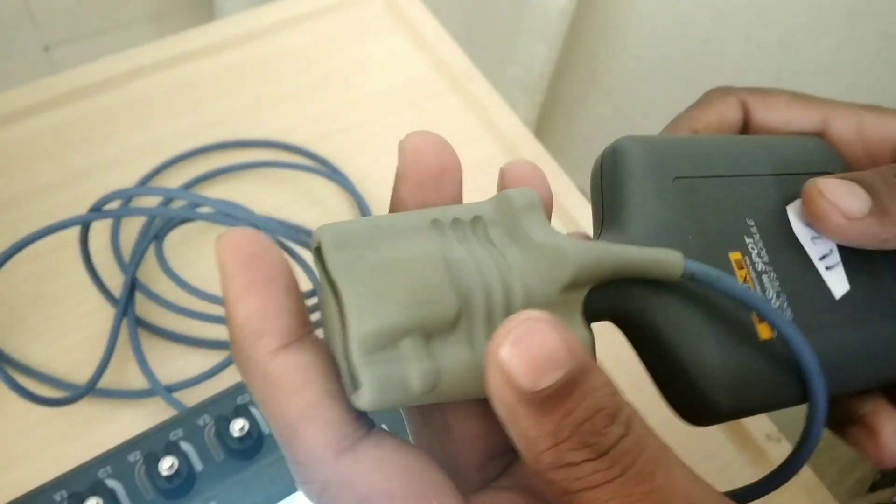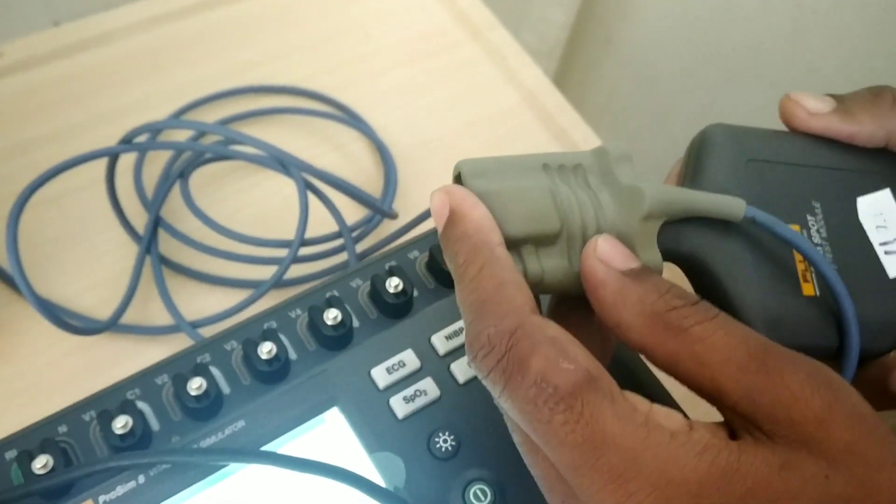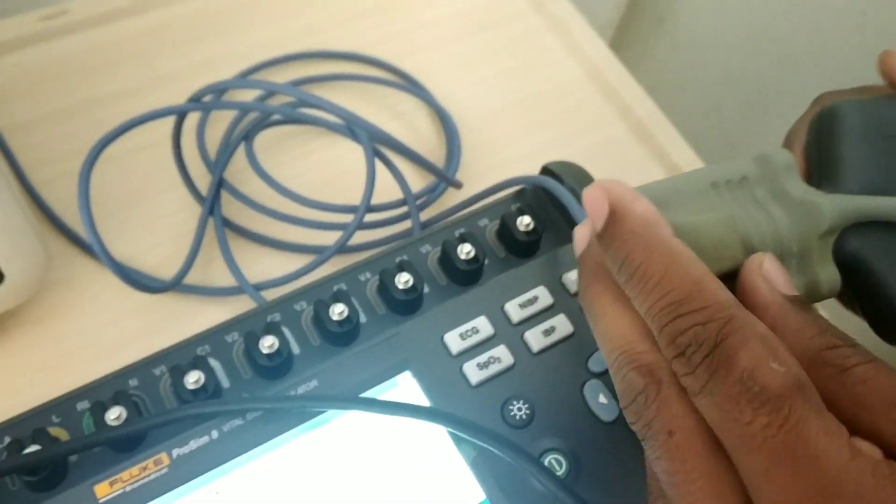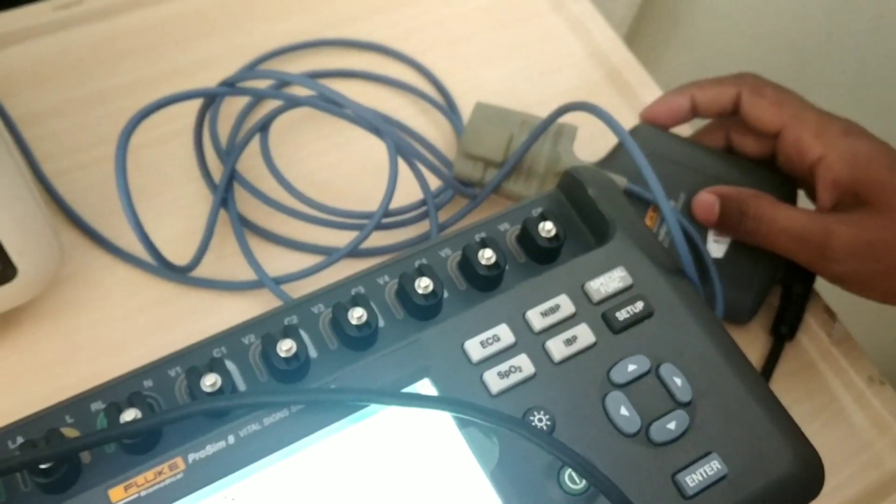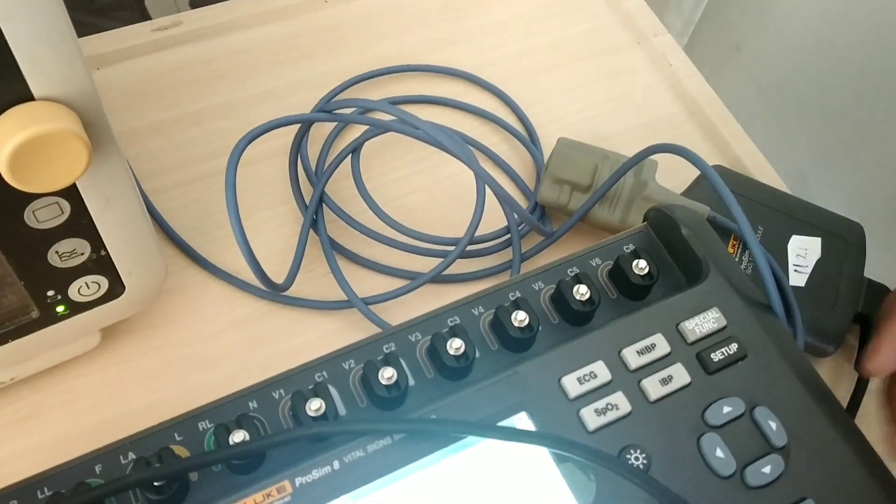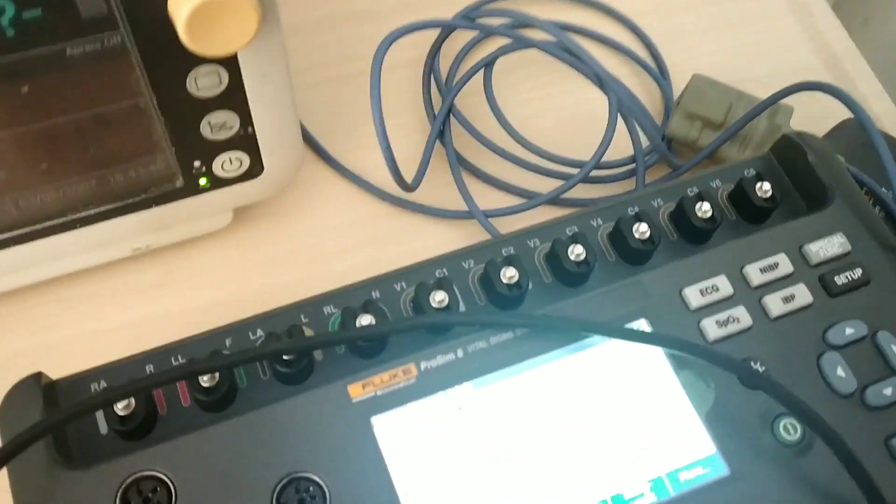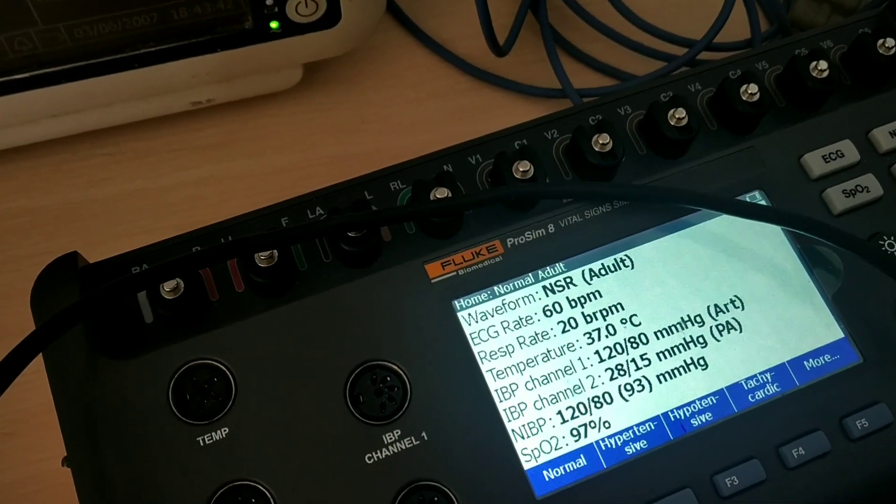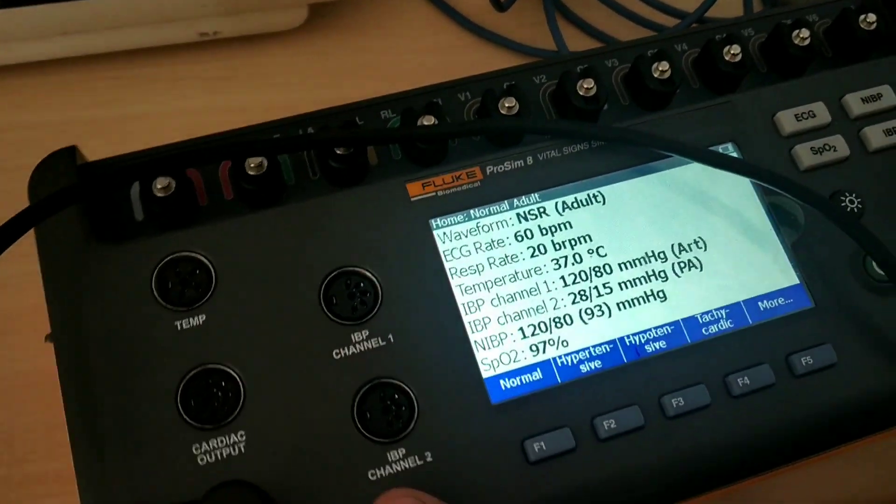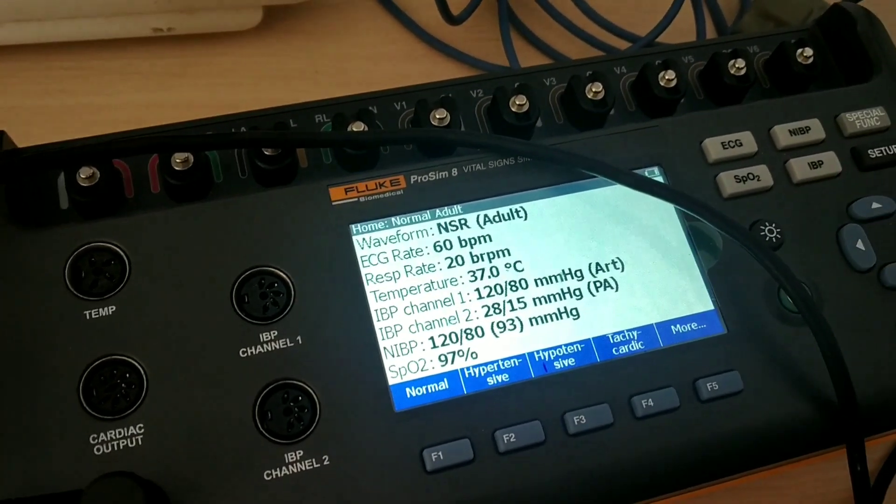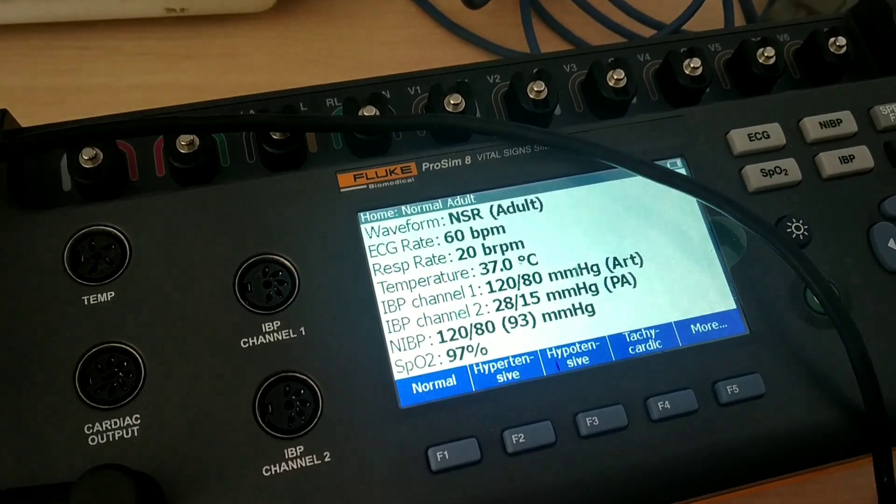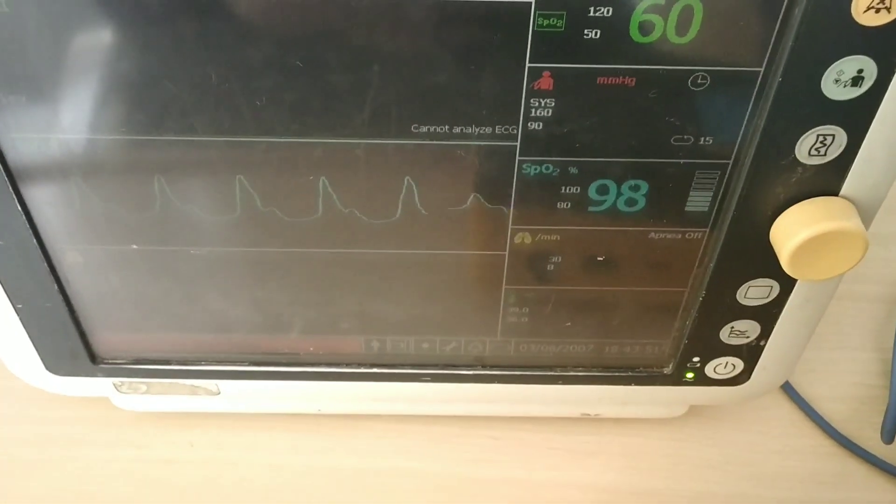After making sure that it is placed correctly, we will go to the simulator and adjust the values. You can see SpO2 97%, so we will adjust the values and then we will see what value is coming on the patient monitor.